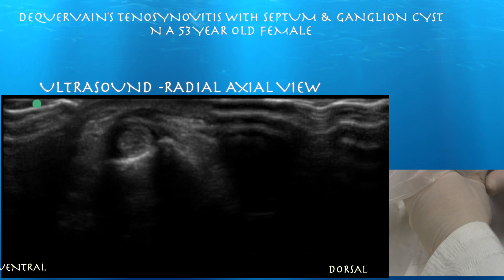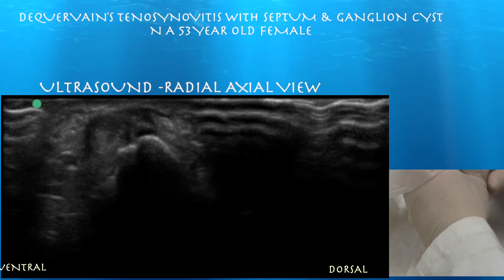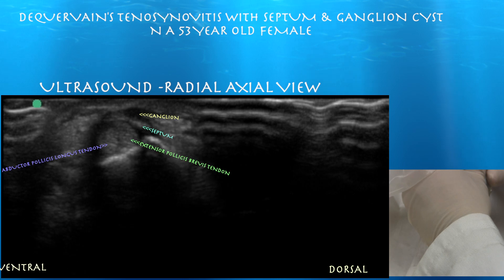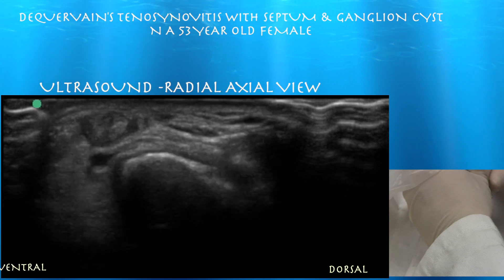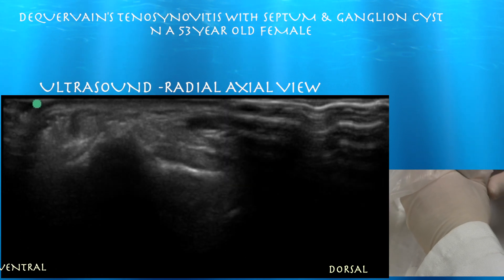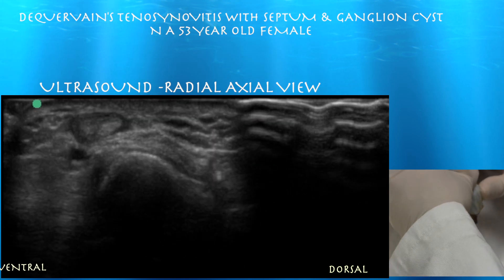Here we are looking at an axial view, and we can see a septum which is shaped like a T. Here's one portion of this septum. You can make out the extensor pollicis brevis tendon as well as the abductor pollicis longus tendon within the first compartment. The ganglion is sitting just superficial to the first extensor compartment, and this septum separates the ganglion from it. There is also a septum within the extensor compartment itself, which is more vertically oriented.